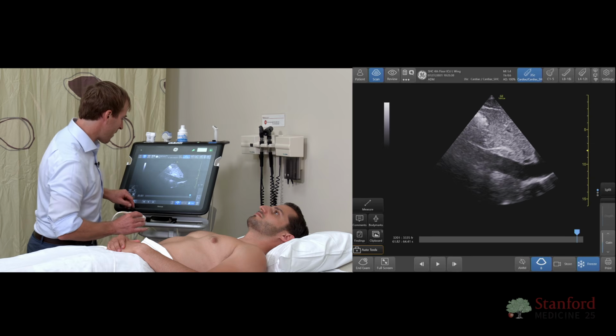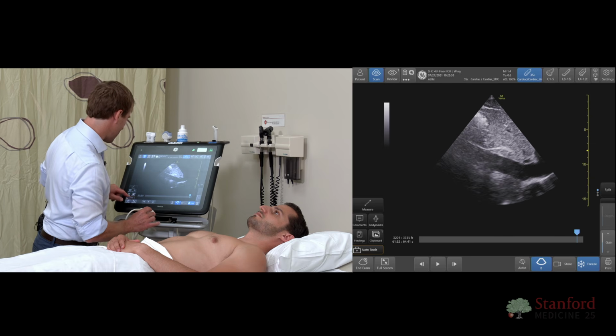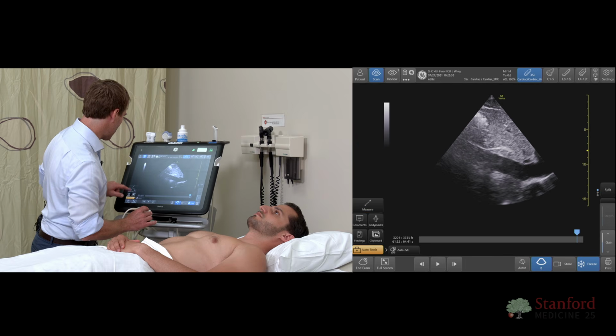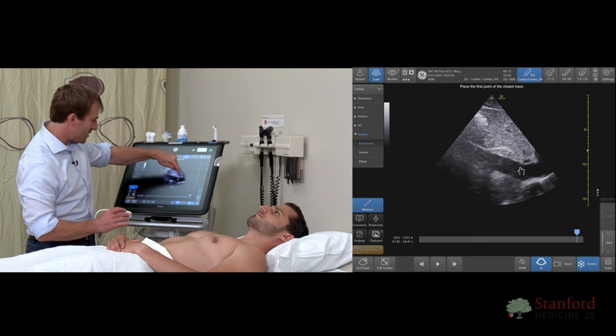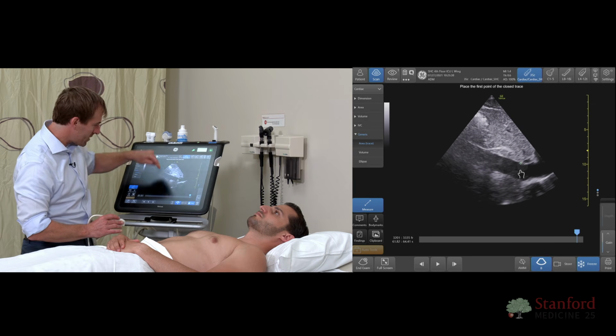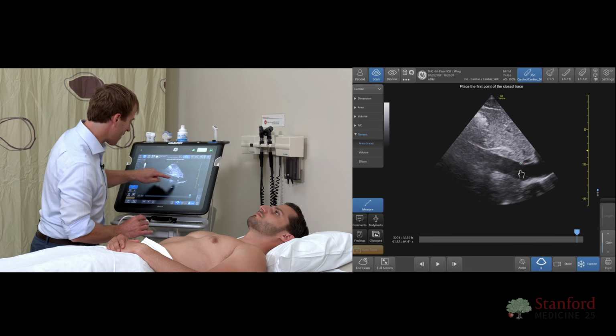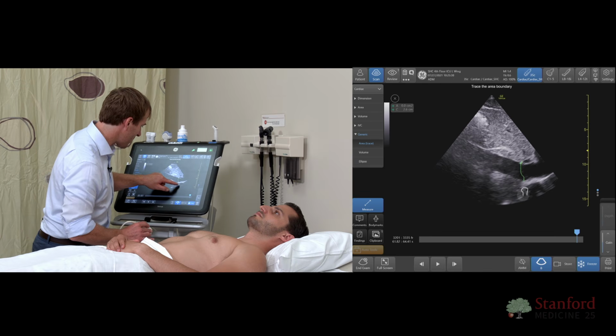To take my measurement, I guess this one can even do it auto. Let's go ahead and slide over here. Now, we can see this is our hepatic vein right here. So I can go right next to the hepatic vein, okay? And now I'm going to slide down. Ooh, got a little bit of a curve there.